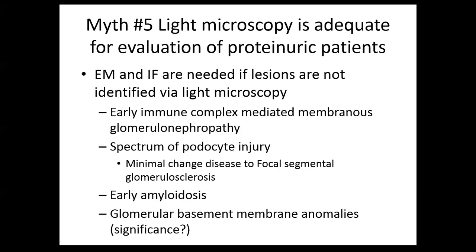When podocytes are reversibly injured, then you have minimal change disease, and that means that podocytes have evidence of vacuolation, they have foot process effacement, but they haven't died. And that's a whole spectrum of podocyte disease processes. I will say in veterinary medicine, minimal change disease is extremely rare. It's exceedingly rare. And focal segmental glomerulosclerosis is quite common.